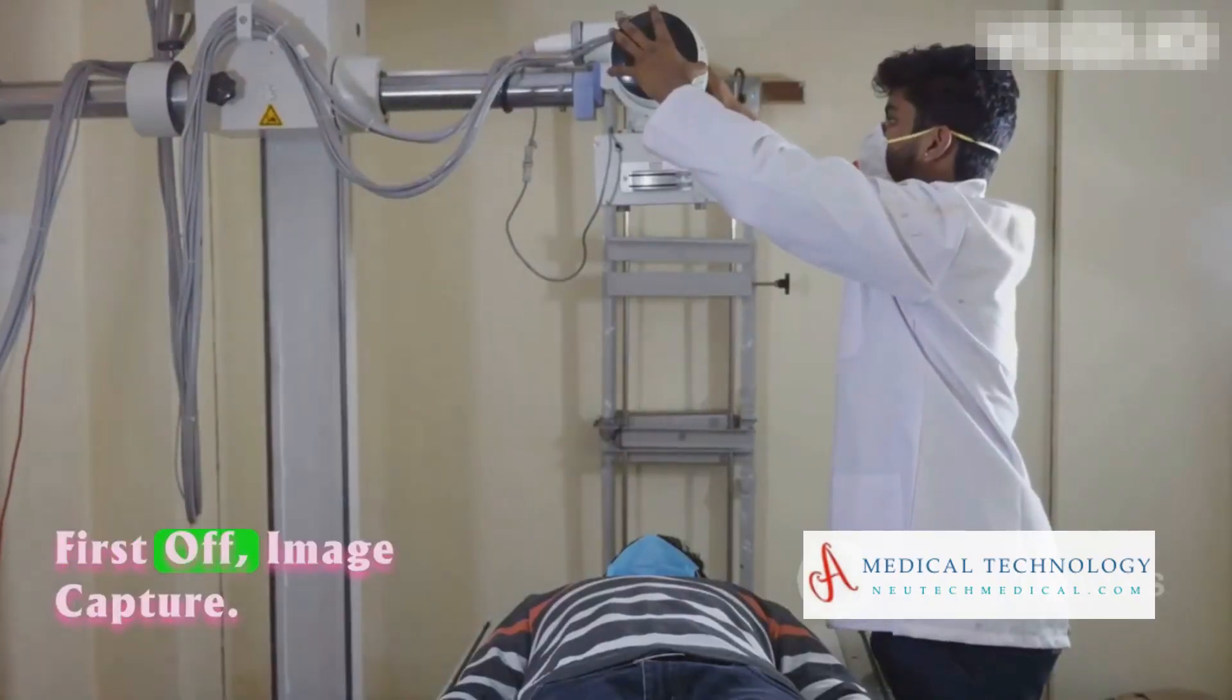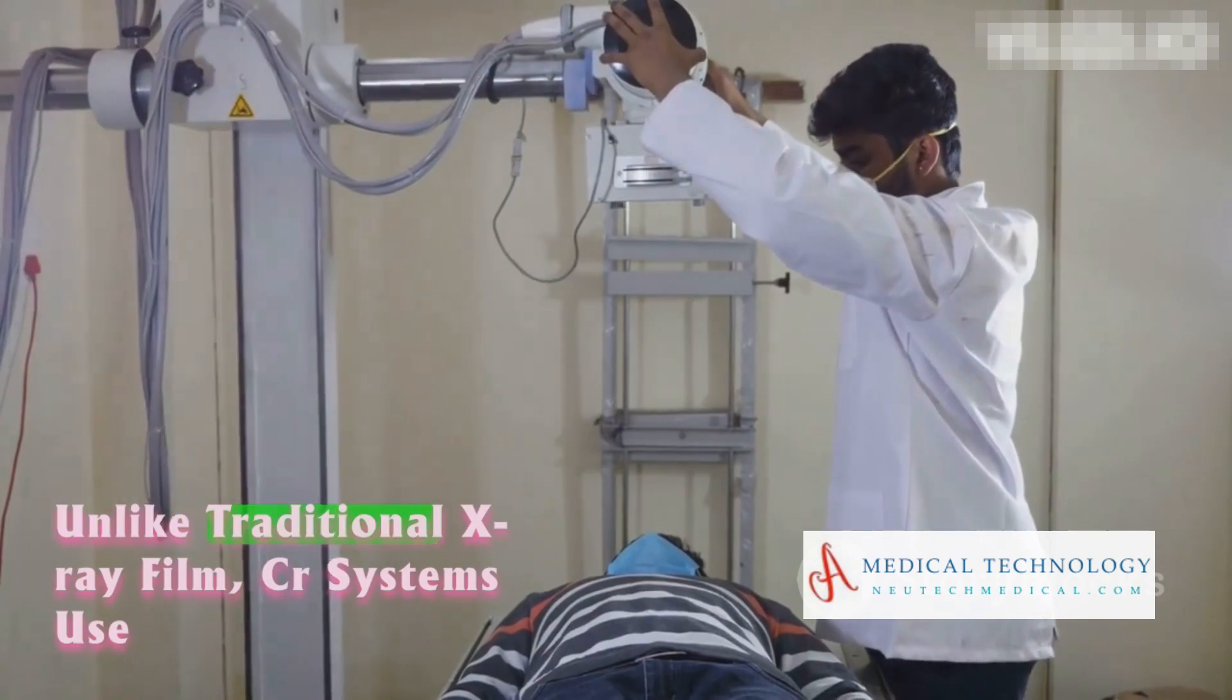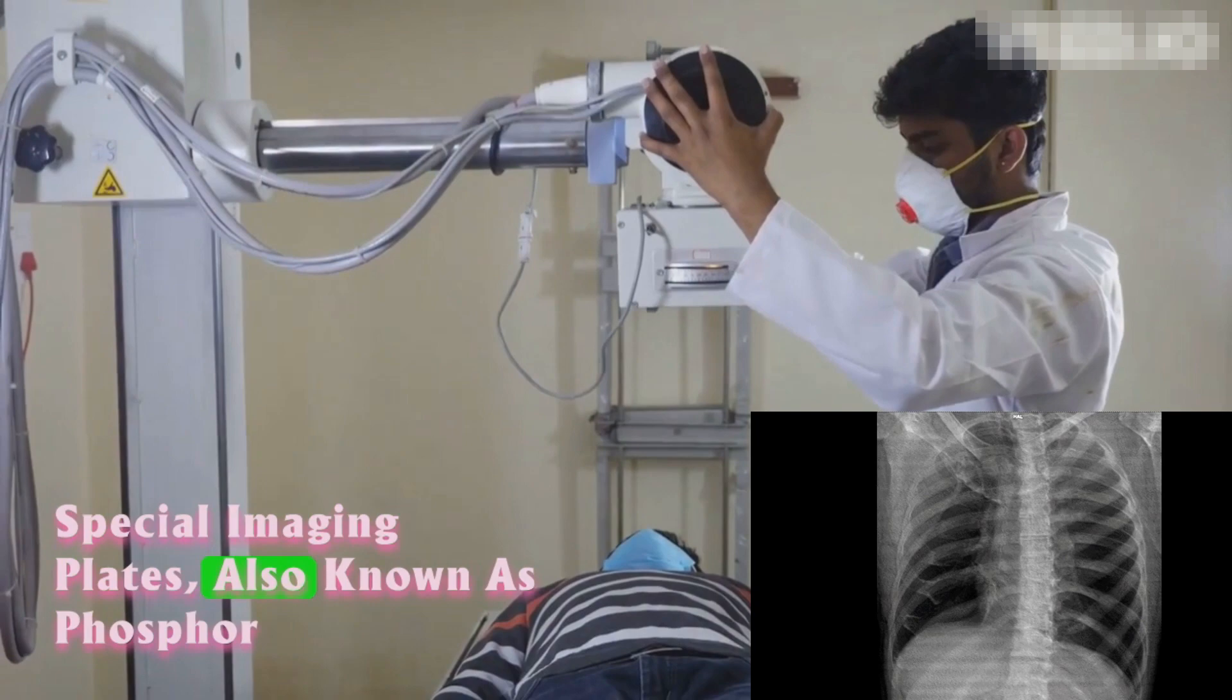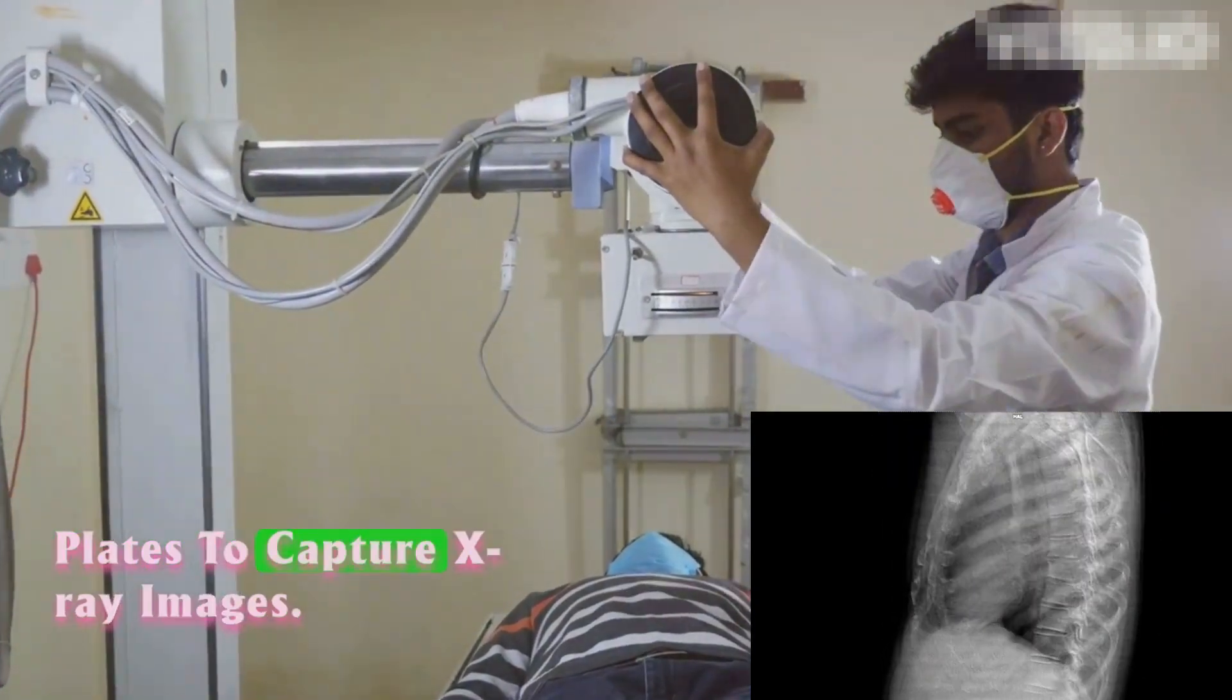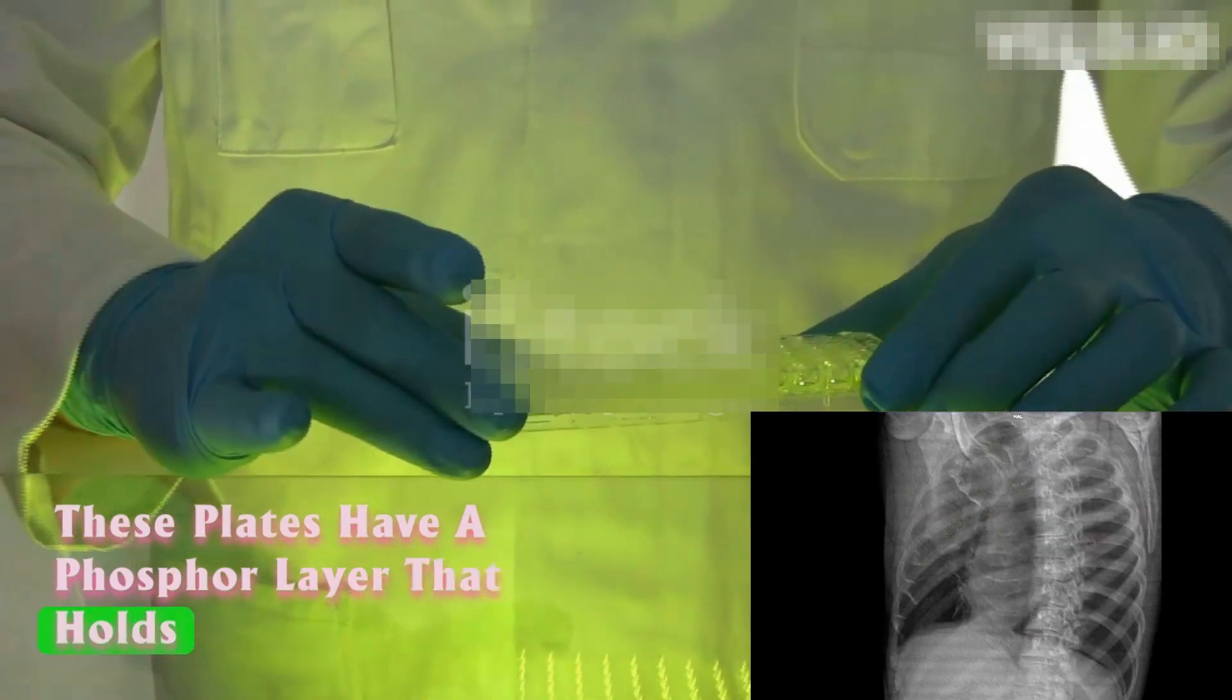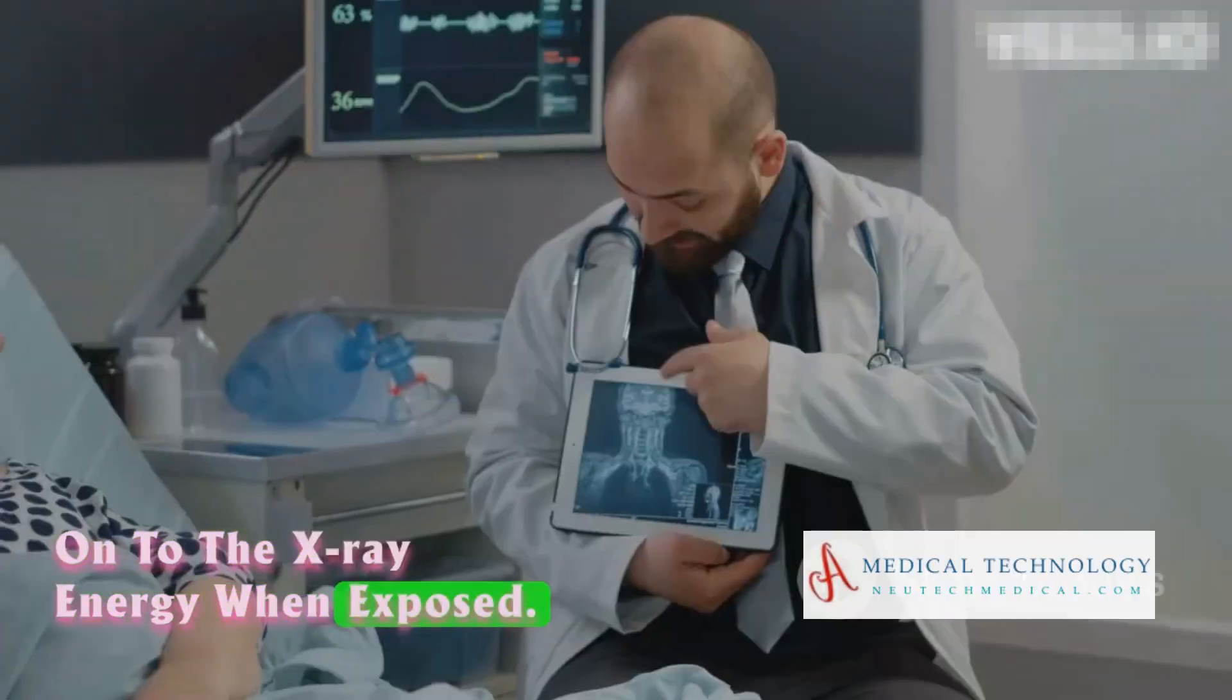First off, image capture. Unlike traditional X-ray film, CR systems use special imaging plates, also known as phosphor plates, to capture X-ray images. These plates have a phosphor layer that holds on to the X-ray energy when exposed.